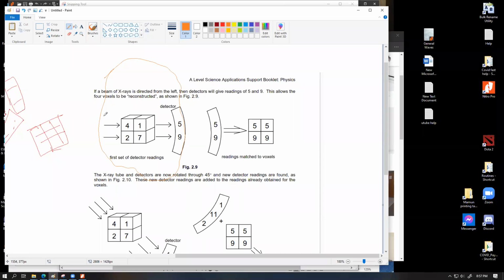Through this mechanism, we are actually measuring one slice of the patient. This is actually 3 dimensional, which is difficult to show here, so I'll draw a 2 dimensional view. Say this is my torso. This apparent rectangular box is my torso from the front. This is my shoulders. This is the corner parts of my torso, and here are my legs, and then here is the head with a bit of a neck and hands coming out. A bit more realistic figure for a human being. By my standard, it's a very beautiful figure. So let's say this is a human being.